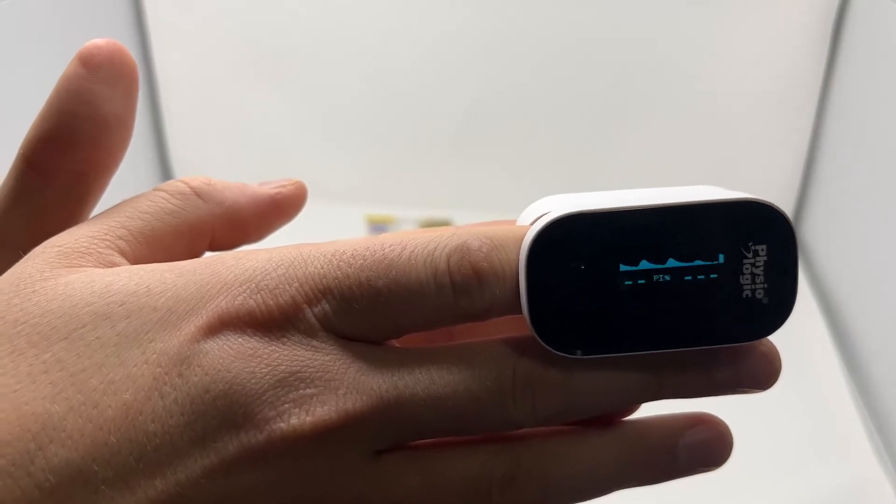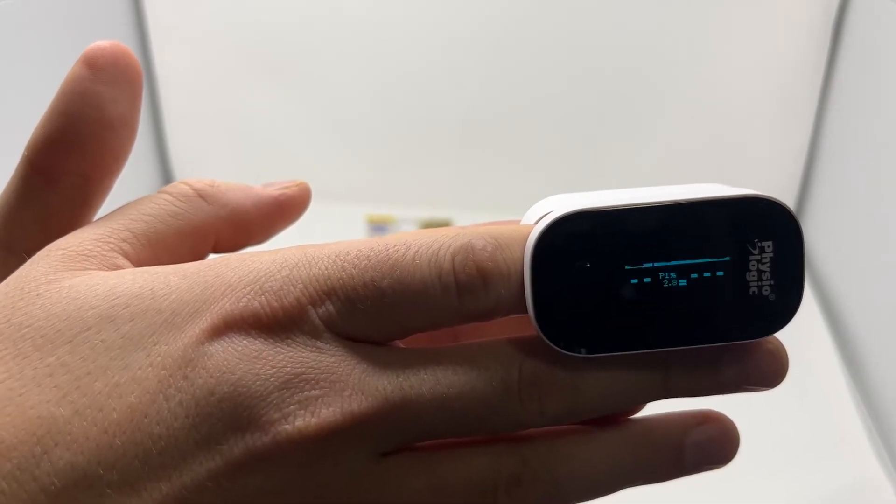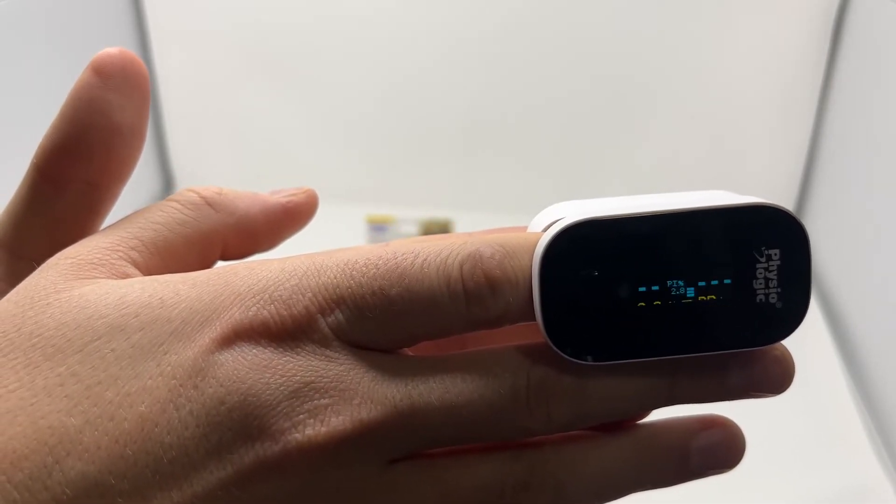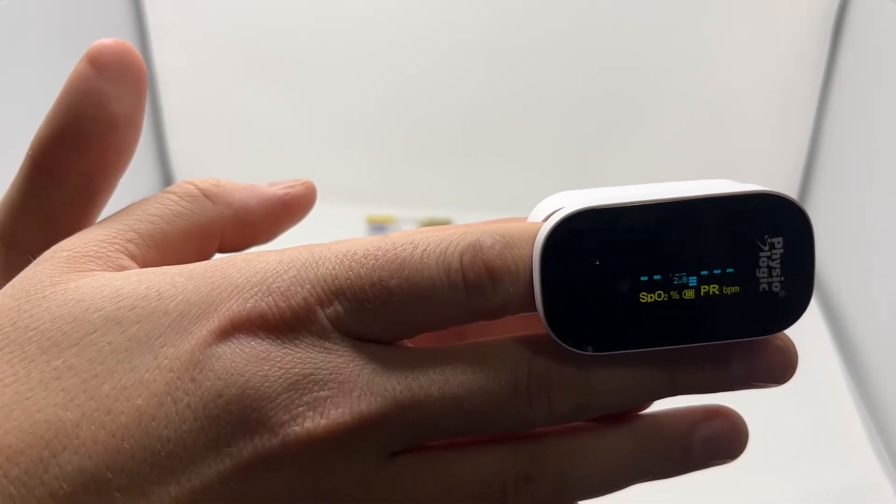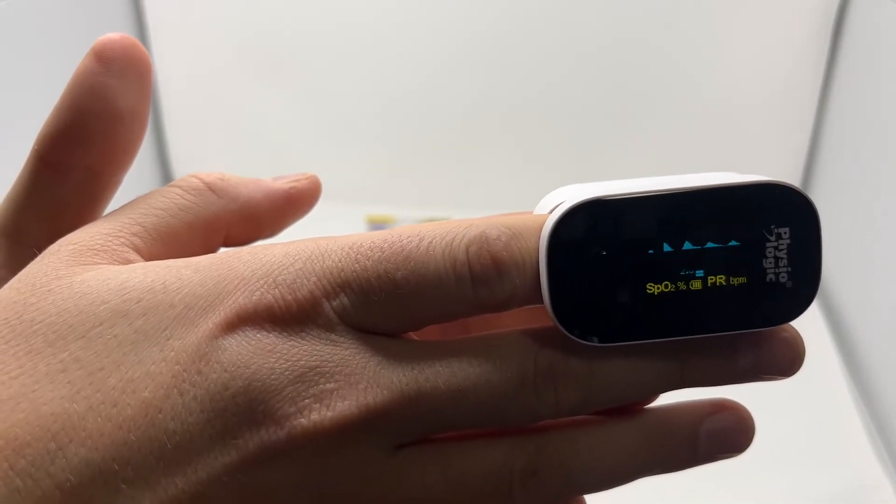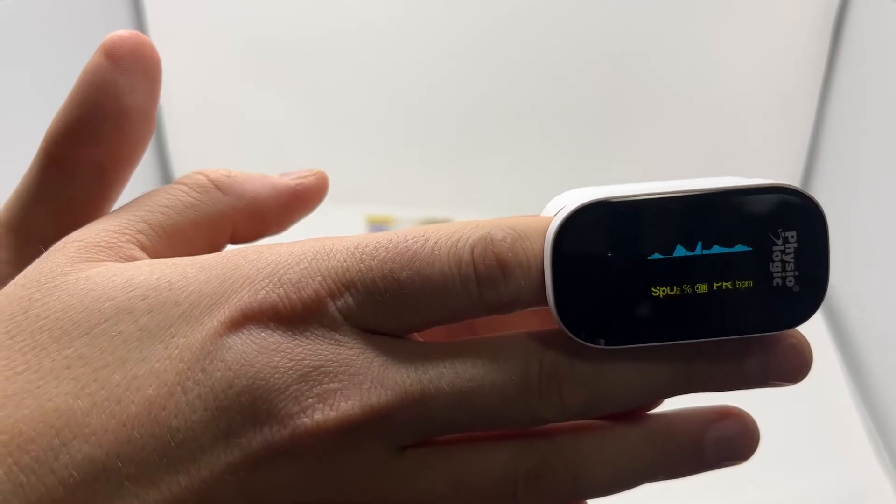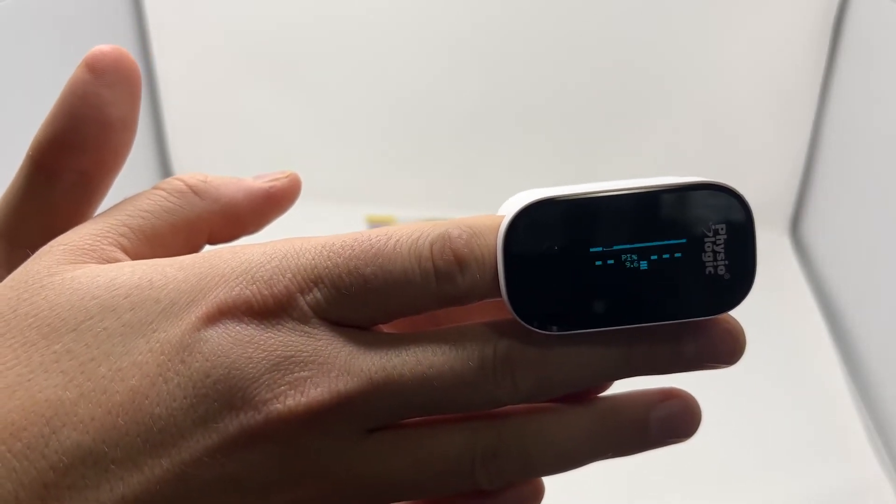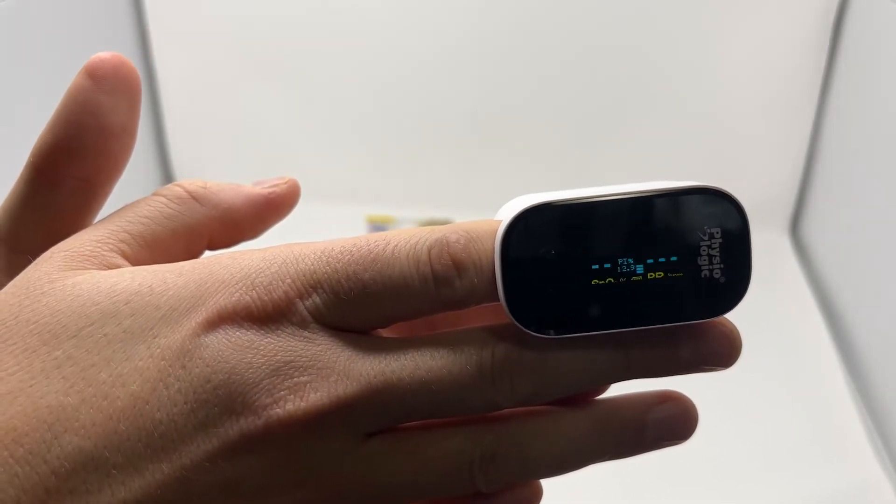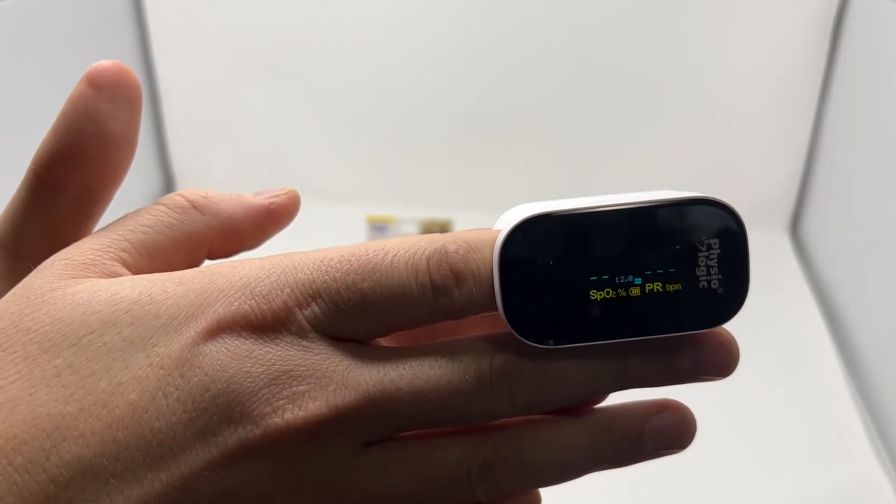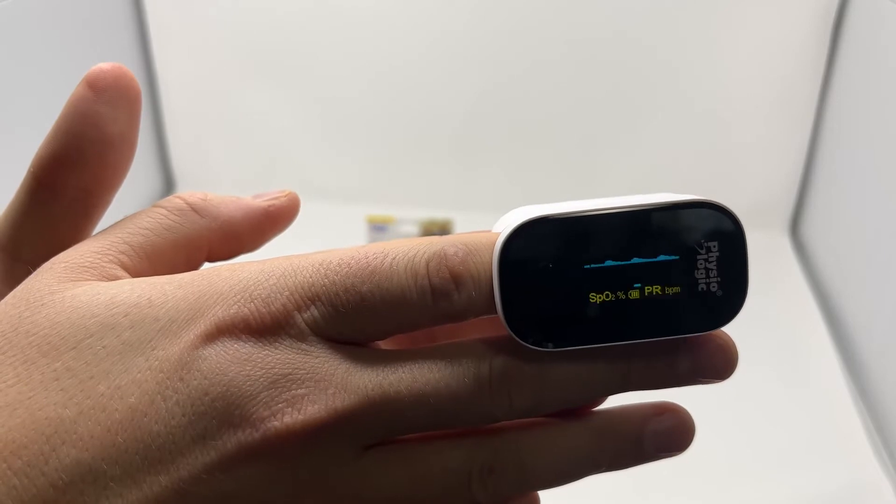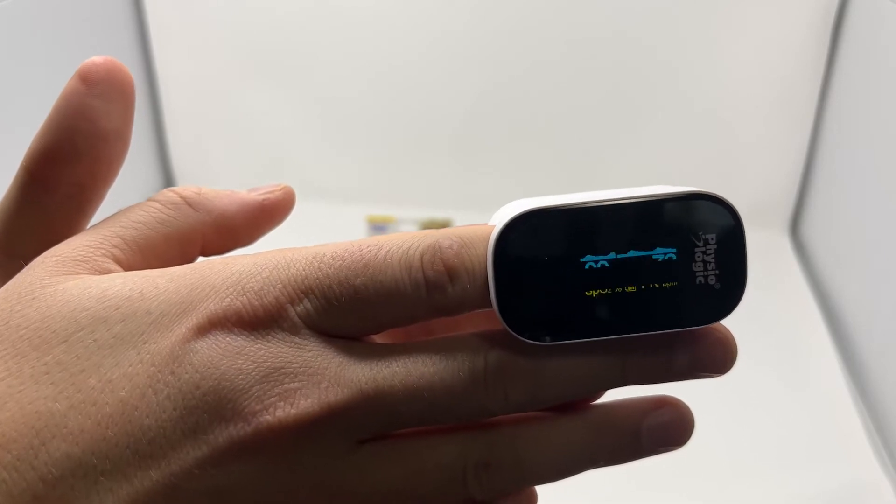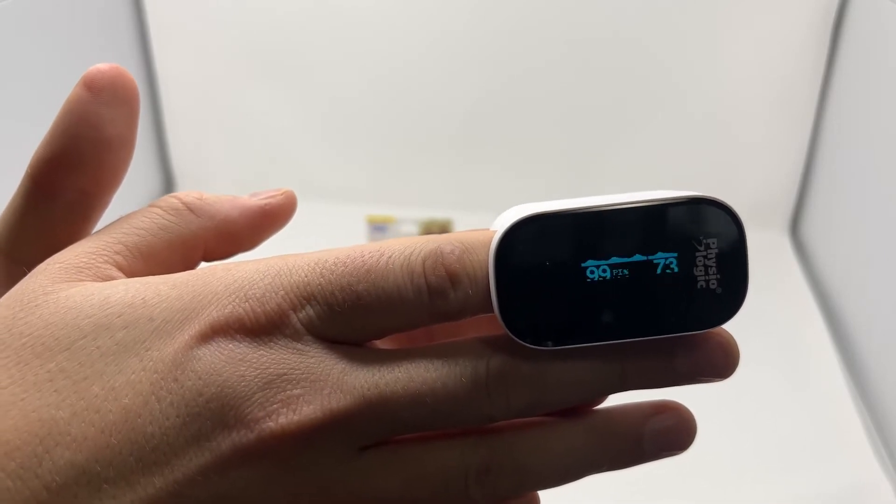Once it gets a reading, we'll get our SpO2 measure. This takes a moment to kind of get a good reading going. So there we go, we have a pulse oximeter 99.